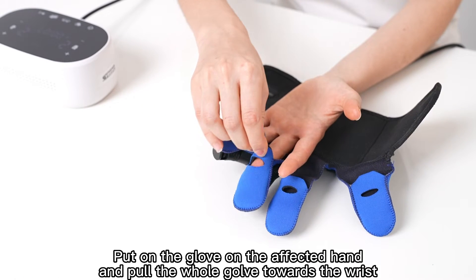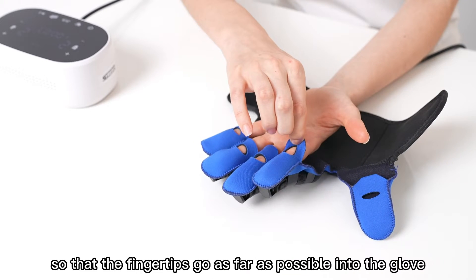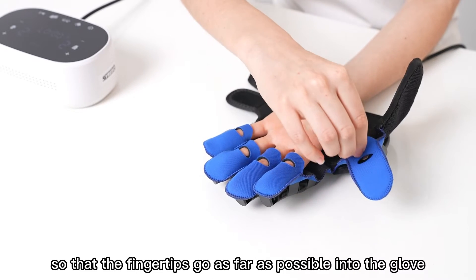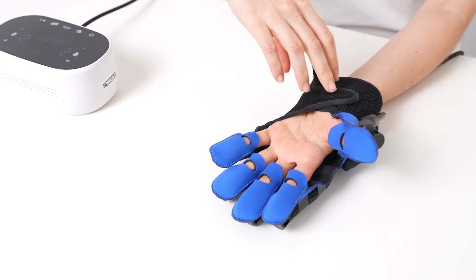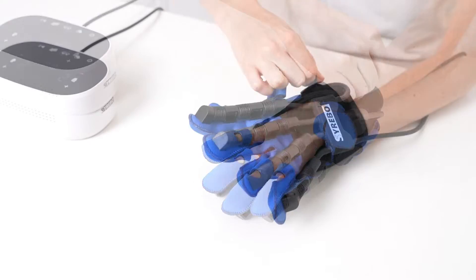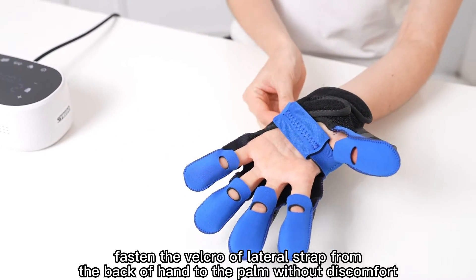Put on the glove on the affected hand and pull the whole glove towards the wrist, so that the fingertips go as far as possible into the glove. Then tighten at the wrist. Fasten the Velcro of the lateral strap from the back of the hand to the palm without discomfort.